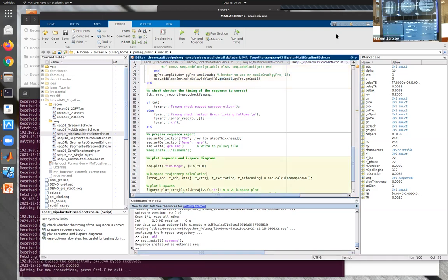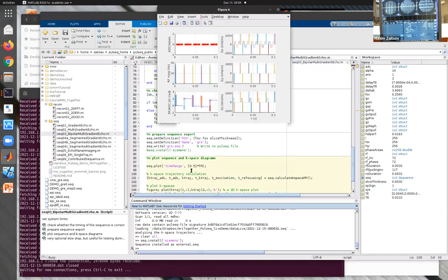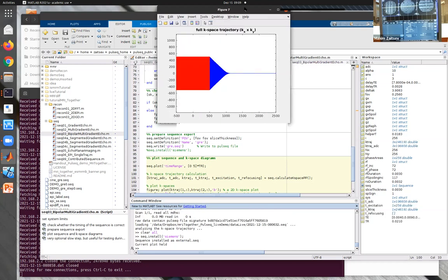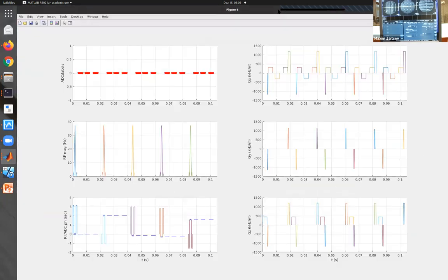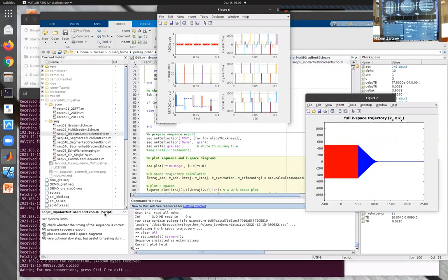And if you plot it, you will see it's now a bipolar gradient, but the k-space still looks the same. So, you see we now have positive and negative gradients. And if we had time, we could squeeze in the timing a bit more to make the echo timing, echo spacing, quicker. Or we can convert the sequence into the segmented gradient echo.